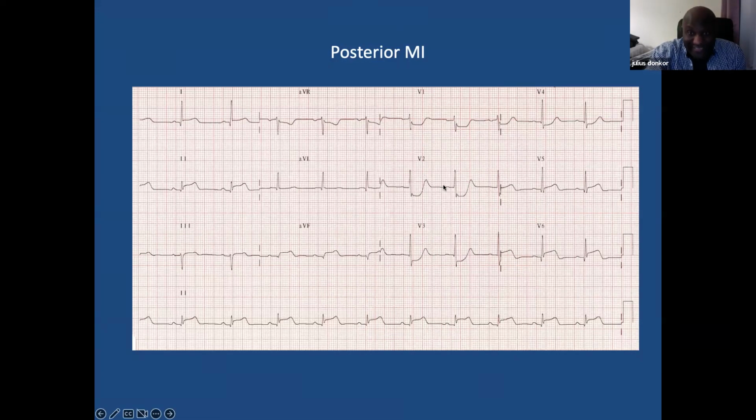So these are ST depression, and what a lot of cardiologists do, because it's a posterior MI, is a posterior ECG recording, like we spoke about, in the same horizontal plane as your V4, V5, V6. You have V9, V8, V7. I should really have a picture here, shouldn't I?